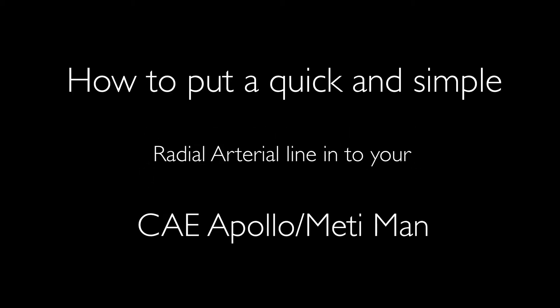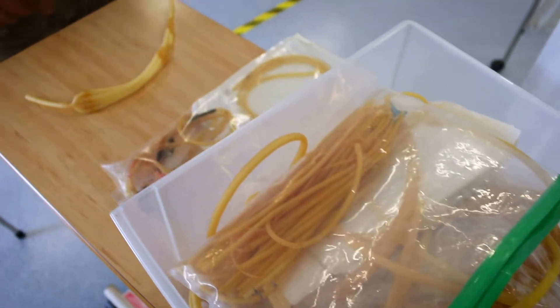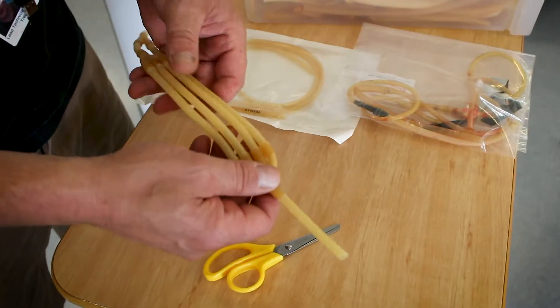Okay, hi everybody. Today we're going to show you a quick mod to put an arterial line into your Metiman or Apollo. It's quick, simple, and works really well. First, you'll need a piece of rubber tubing.